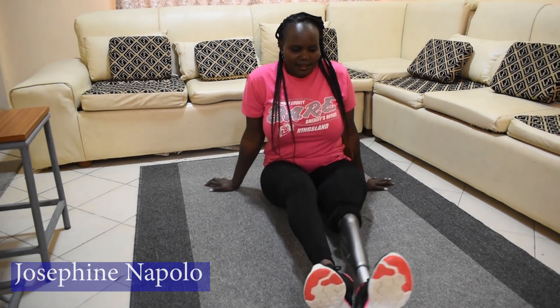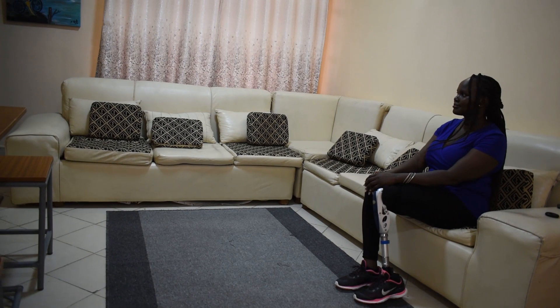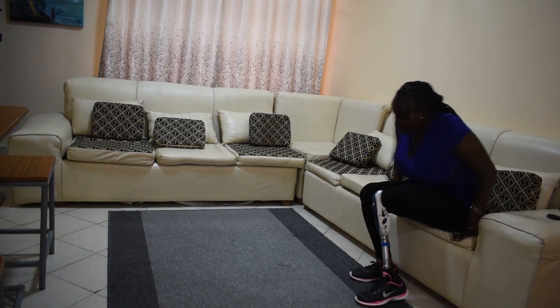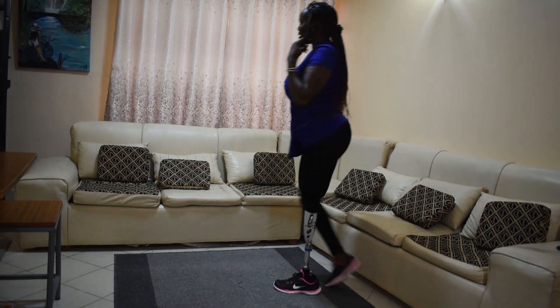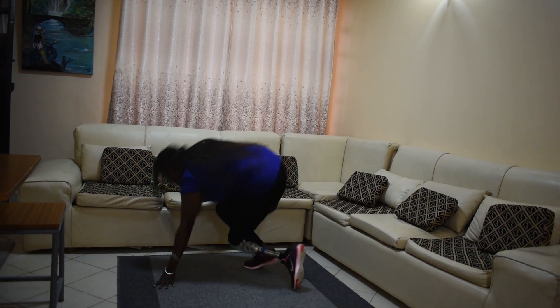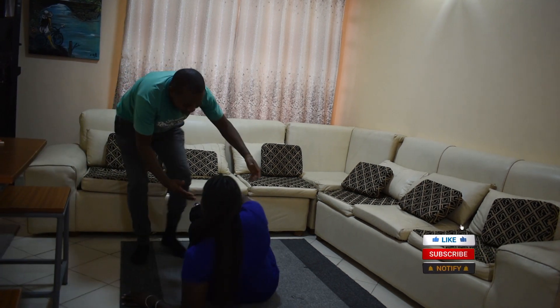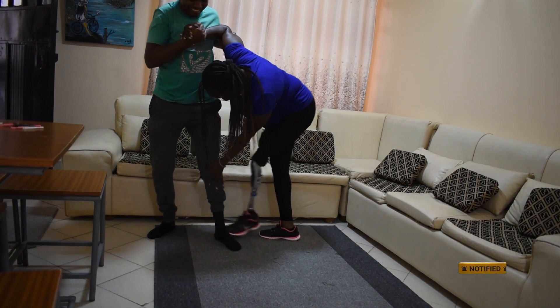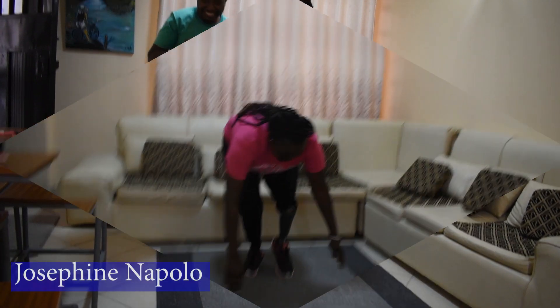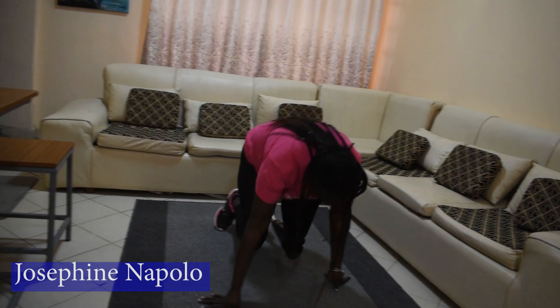I remember my first time when I fell down. I was so helpless and unable to stand up on my own. I was so confused at first. I tried to sit and stand — it wasn't easy at all. I actually didn't know what to do next. I had to be supported to stand up.